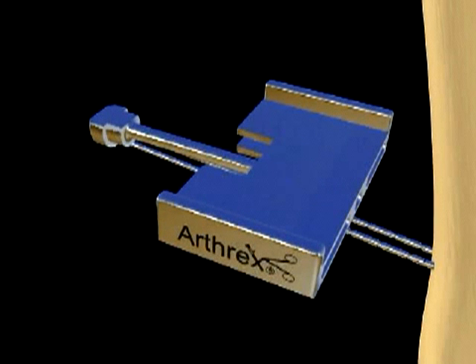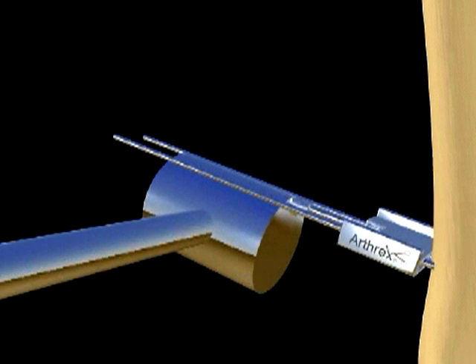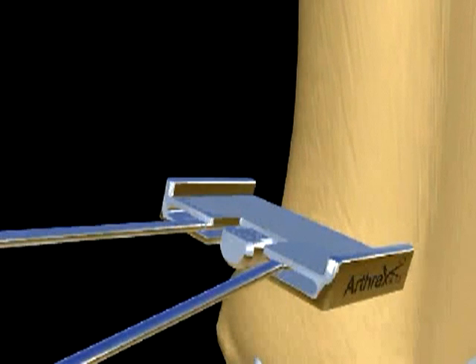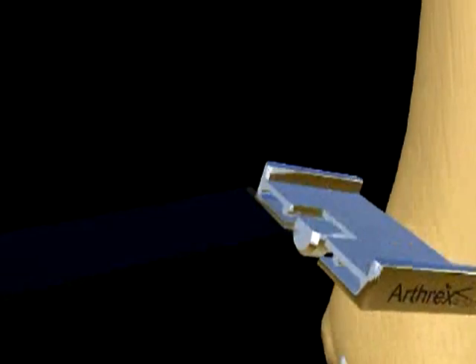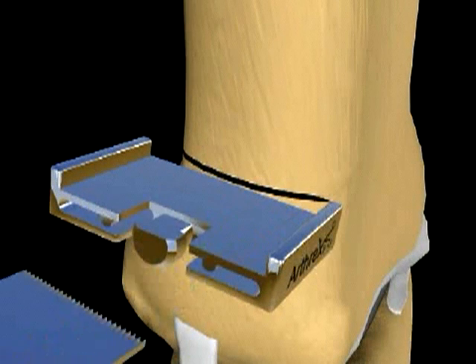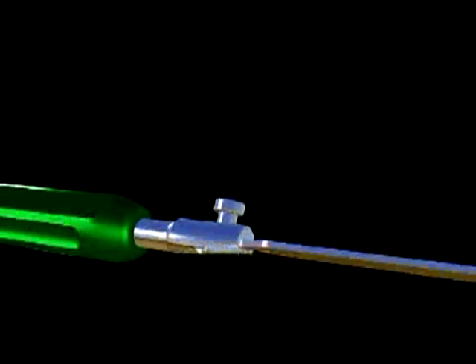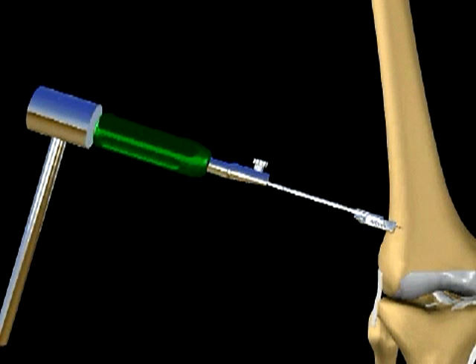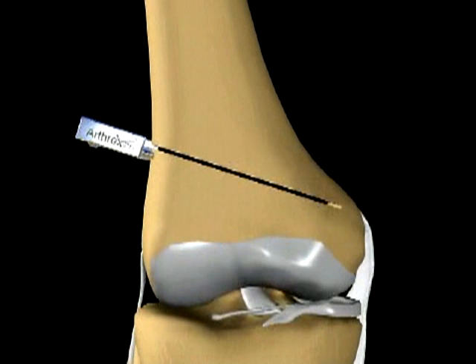The osteotomy cutting guide is placed over the guide pins. Once secure, the breakaway pins are shortened and a sagittal saw is used to perforate the femoral cortex superior to the guide pins. Osteotomes in a variety of sizes are used to complete the cut under fluoroscopic control. The depth markings on the osteotome blades may be referenced to the breakaway pins during this portion of the procedure. The osteotomy is made until a cortical hinge of bone is left medially. Once the osteotomy is complete, the breakaway pins are removed.